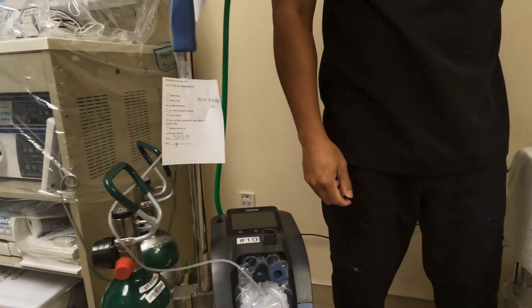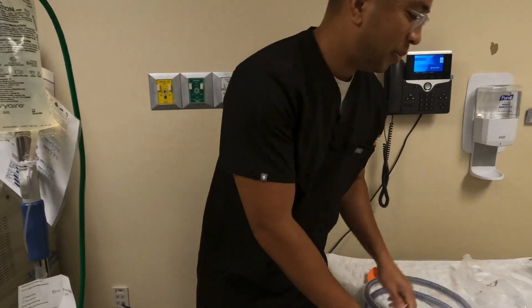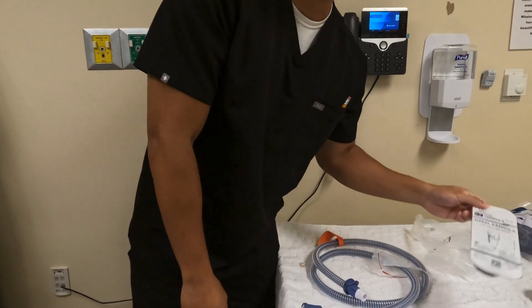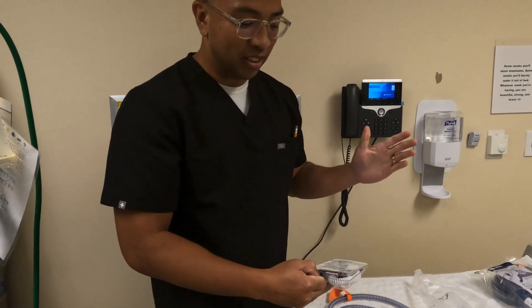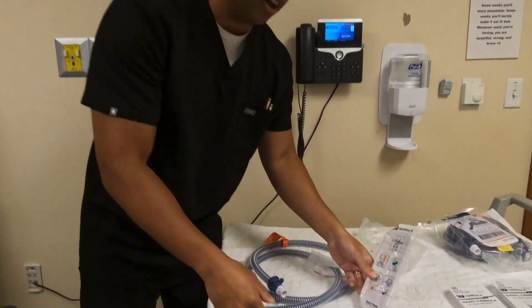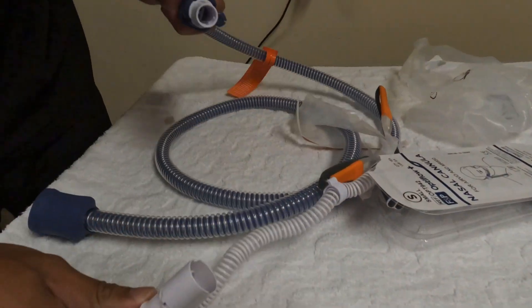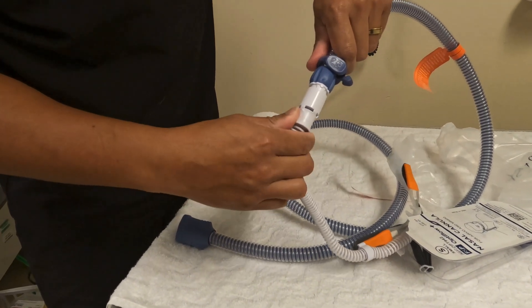Next, we're going to attach the circuit with your selected interface. Today we'll use small. Make sure the prongs do not fully occlude the airway through the nares — you want to keep some opening to allow for exhalation. To attach, you'll match the grooves together and you'll hear a click.